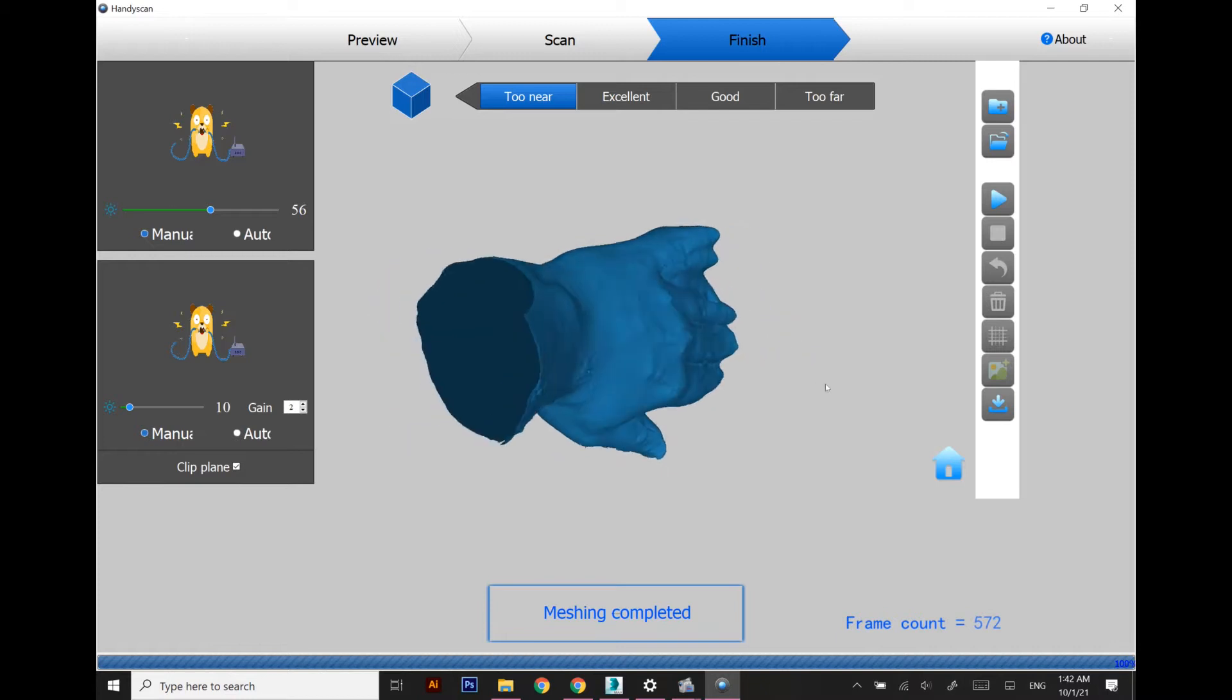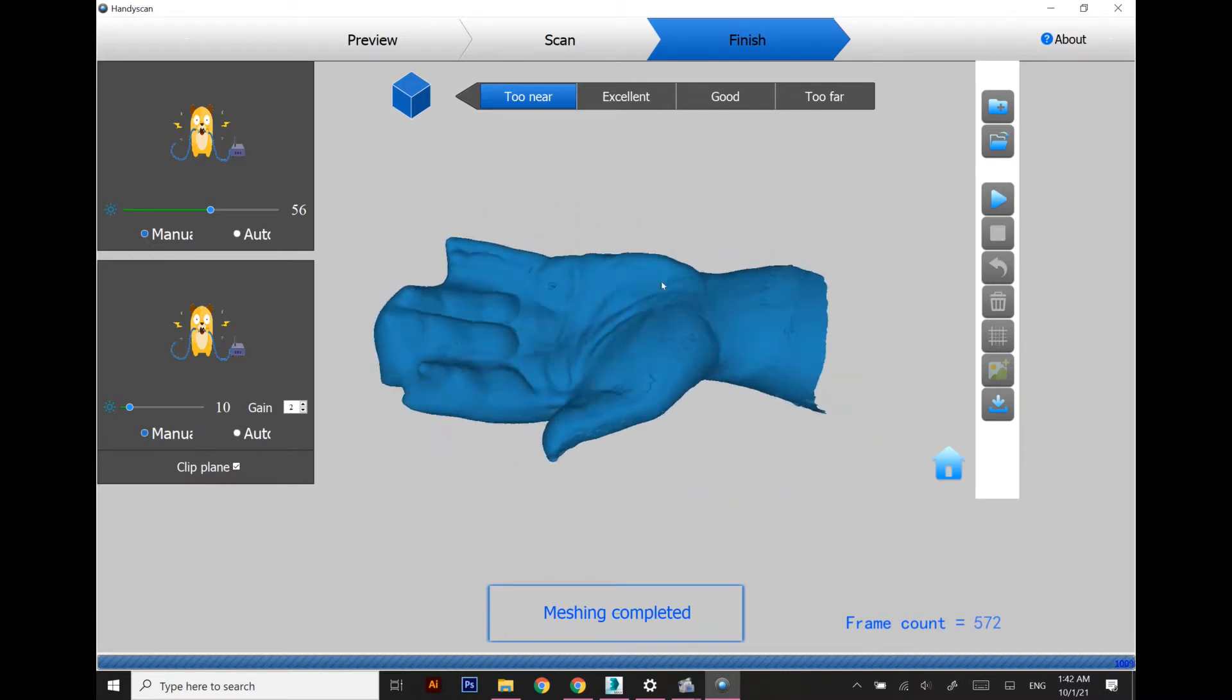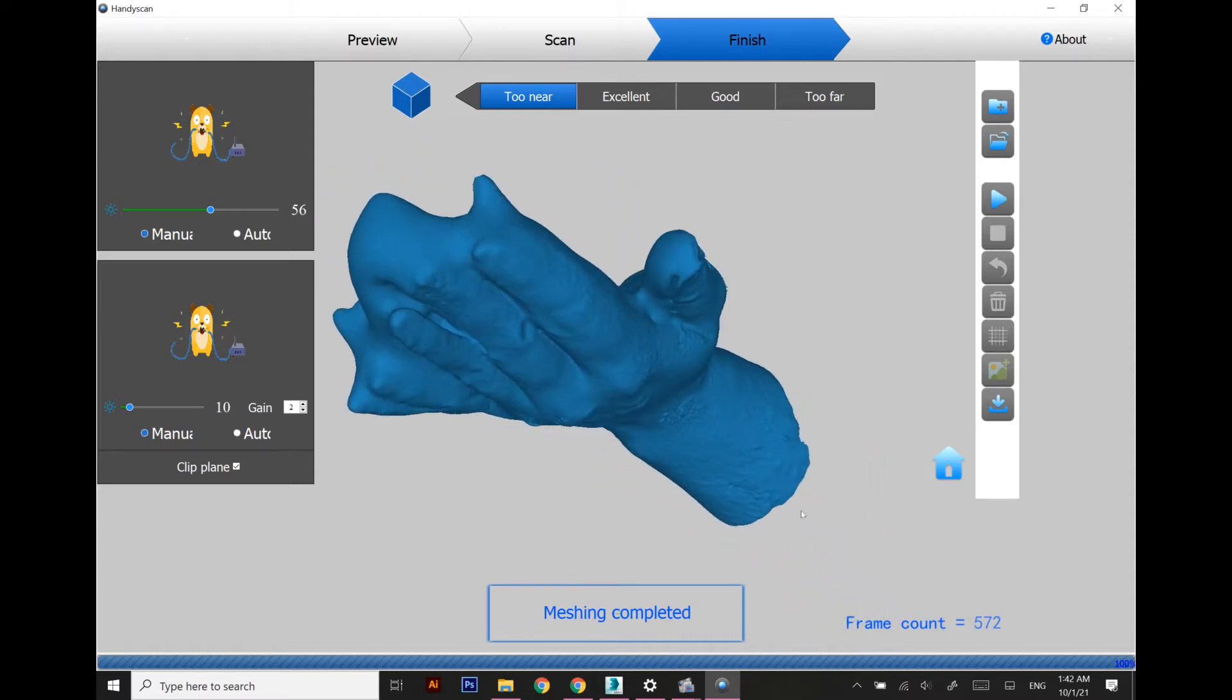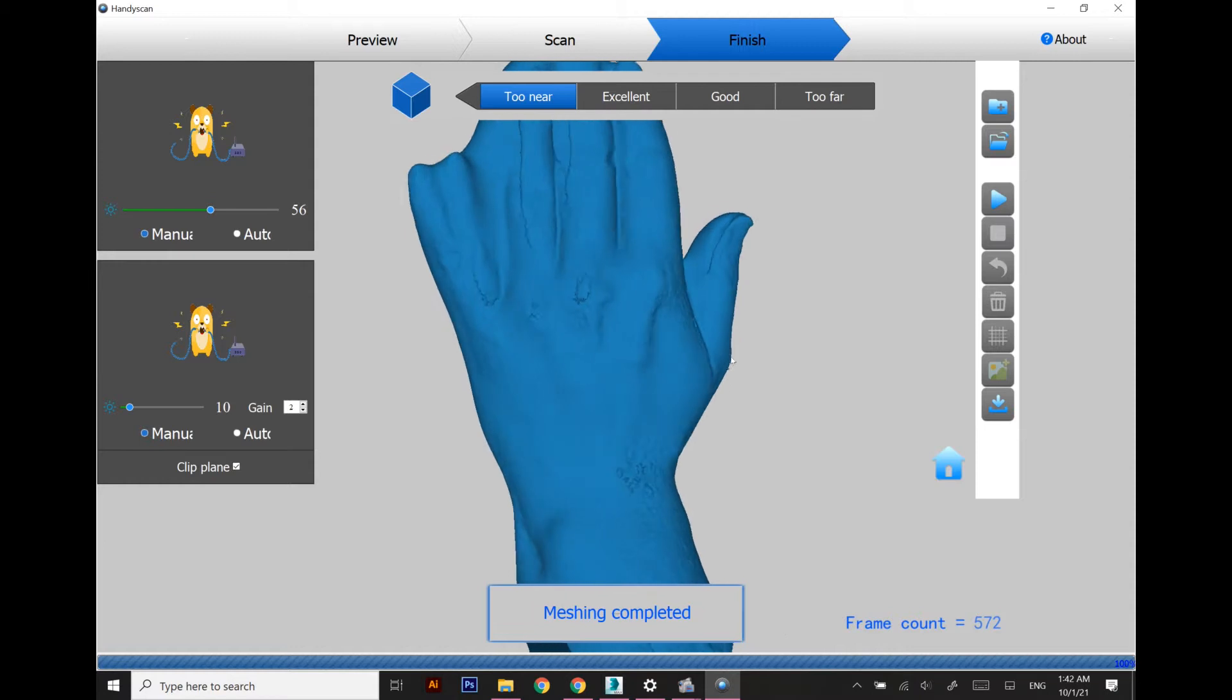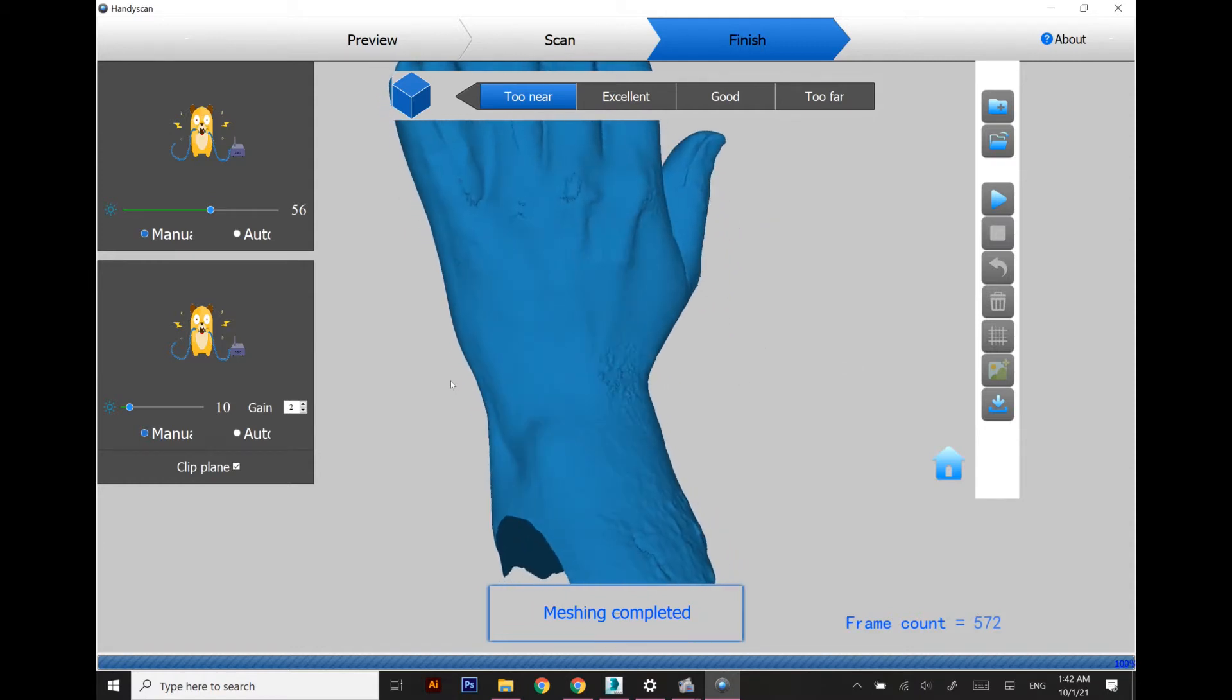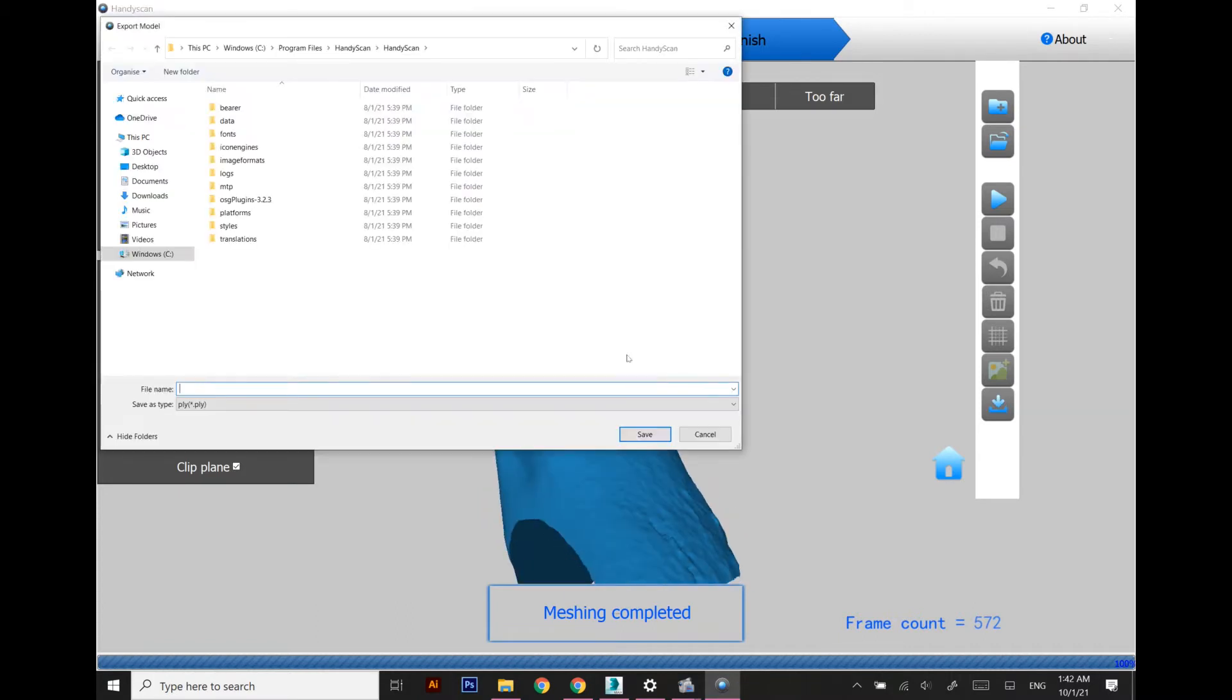The wrist area is quite good enough and the upper thumb part is also okay. This is the required area which I am going to use for designing the splint for my wrist, so I'm going to export this one in OBJ format.